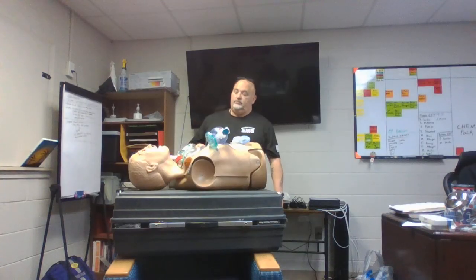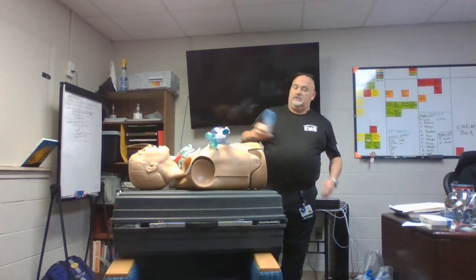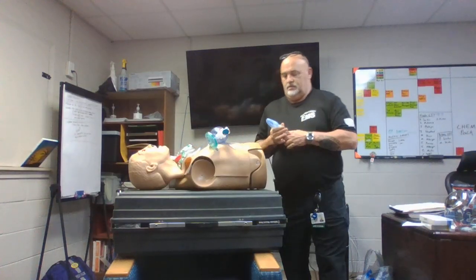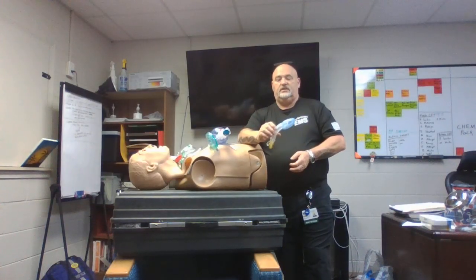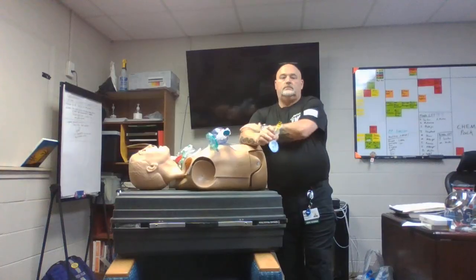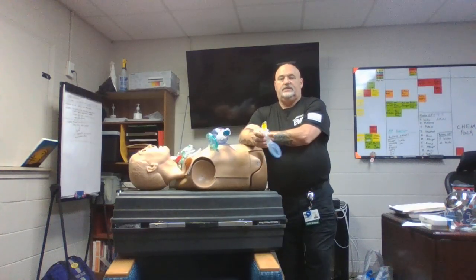So we've talked about the non-rebreather. We've talked about the nasal. We've talked about the adjuncts. We've talked about suctioning. Let's talk about this BIAD a minute. What does that do? Does that really give us a secure airway? No, it does not. It doesn't properly seal off.